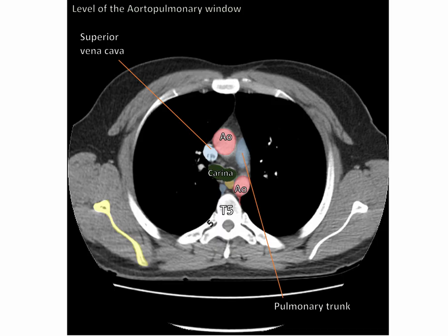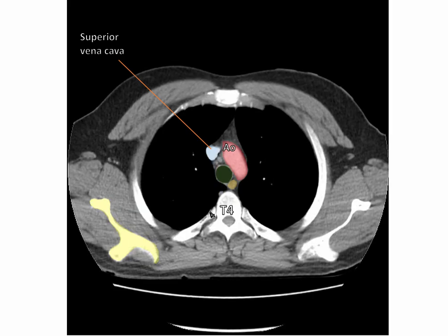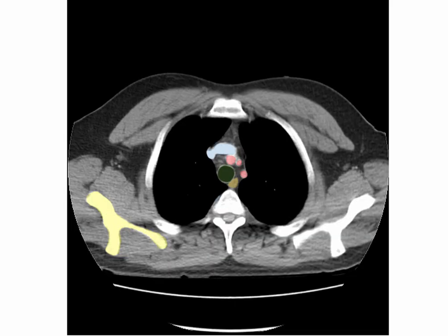This is also approximately at the level of the angle of Louis, or sternal angle. This level is significant as it marks the limits of the aortic arch. As we move superiorly, we can see the two profiles of the aorta joining to form a single profile at the aortic arch level. Also at this level, we can see the azygous vein joining the superior vena cava here. As we move upwards, we can see the vessels emanating from the arch of the aorta and also from the superior vena cava. Here we can see the formation of the superior vena cava from the right and left brachiocephalic veins. Branching from the aortic arch, we can see the brachiocephalic trunk, the left common carotid artery, and the left subclavian artery.